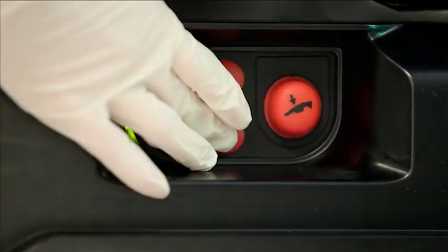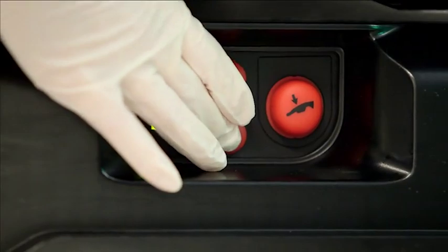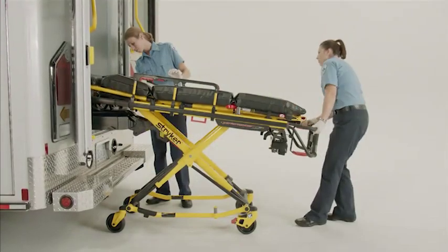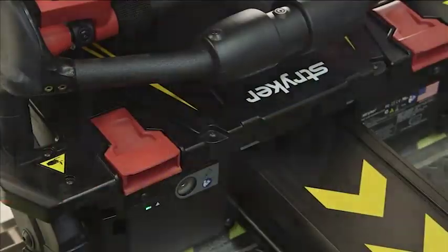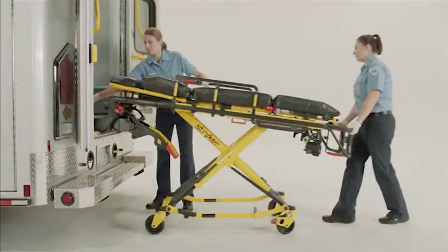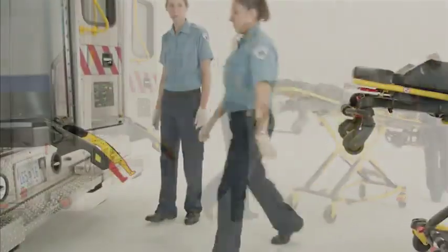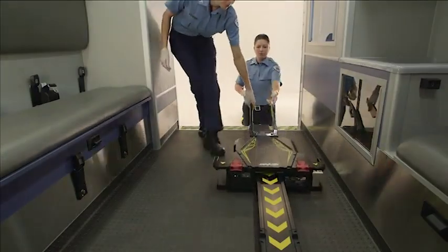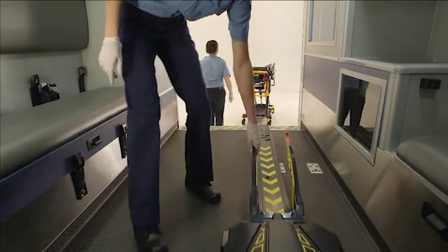The side operator will press and hold the down arrow button on the PowerLoad control panel until the lifting arms have lowered completely. Next, release the cot by disengaging one of the red manual release handles on the top of the trolley. To secure the ambulance, raise the lifting arms and guide the trolley into the patient compartment until it no longer interferes with the ambulance doors.